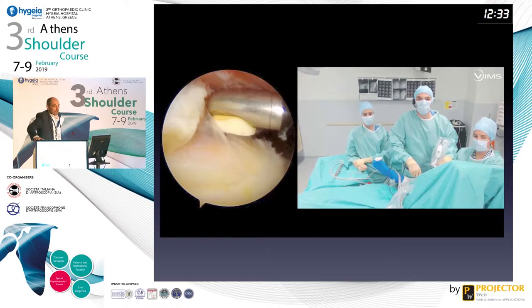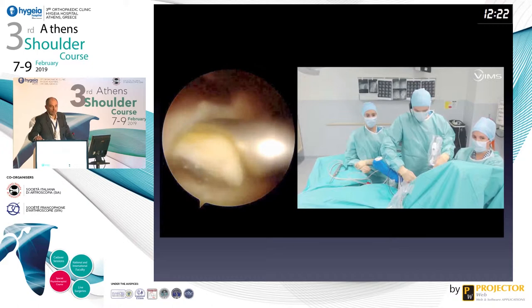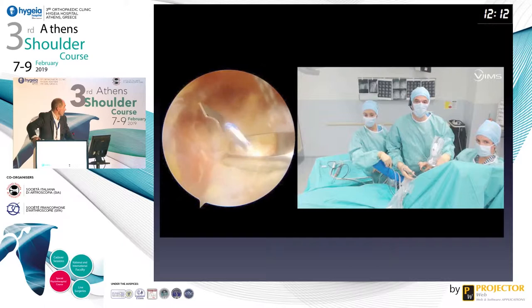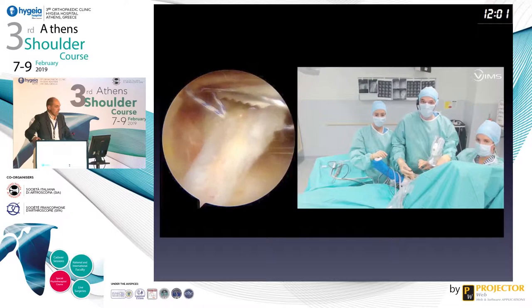Don't cut the teres major, which is just behind, of course. At this step it is very easy, but the connections will become closer and more difficult to understand at the medial part of the tendon. So now we have the upper part of the lat dorsi, and as you can see, I will make the same with a blue suture. So this is very, very hazardous, because you remember the upper part close to the subscap, you have the axillary and circumflex vessels, with the nerve, and you have to go very slowly, step by step.